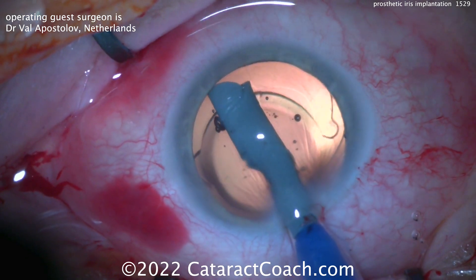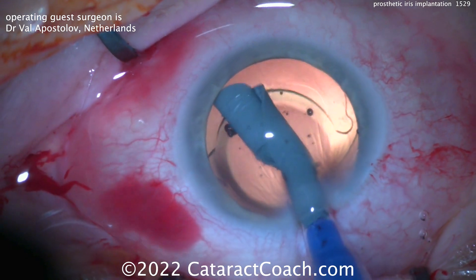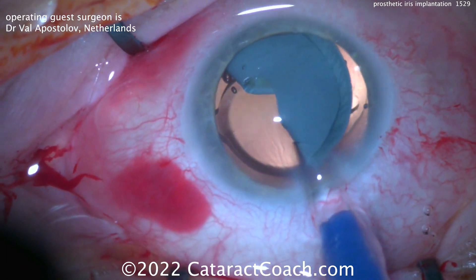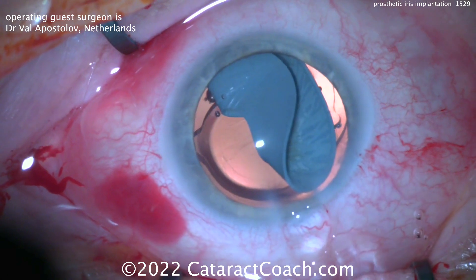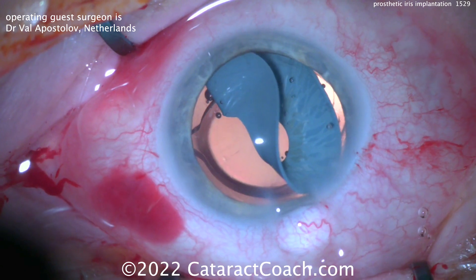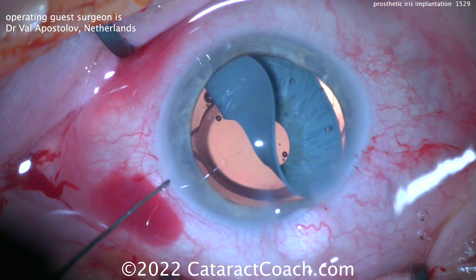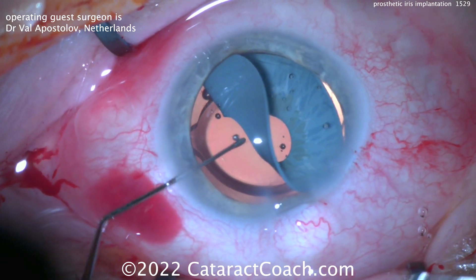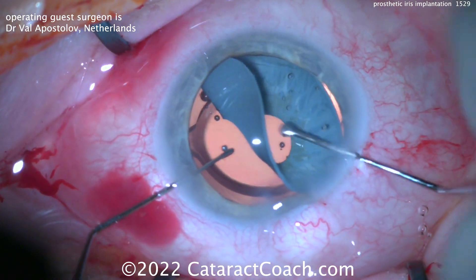You may also want to have an extra paracentesis opposite the main incision. Here it comes going inside the eye — you can see just how big this device is. If you fold it into quarters, you may have an easier time getting it in the capsular bag. Two instruments — I like the two-handed technique here — that's obviously going to be very useful.